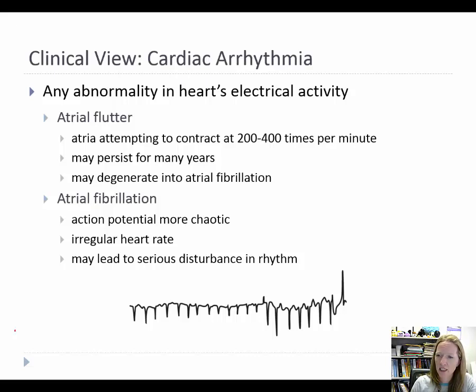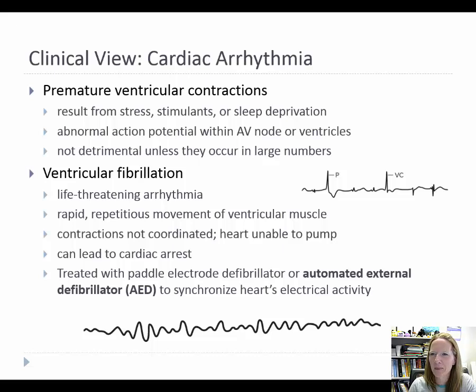So this is taking a look at an ECG of an individual with atrial fibrillation here. There are probably many things that you can see going on. Of course, the QRS complex is upside down, and if you follow along with it, there's no real distinction between the P wave and the T wave. Don't worry, I'm not going to make you analyze abnormal EKGs or anything like that, but again, it's one of those interesting things, right?